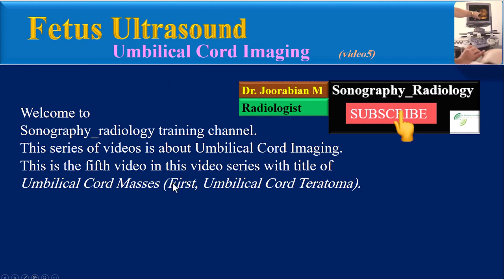This series of videos is about umbilical cord imaging. This is the fifth video in this video series with the title of umbilical cord masses. I will try to briefly explain all the possible diagnoses for umbilical cord masses in a few consecutive videos. This is the first video in this field, for explanation of umbilical cord teratoma.